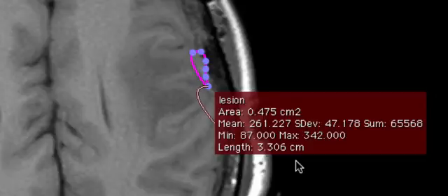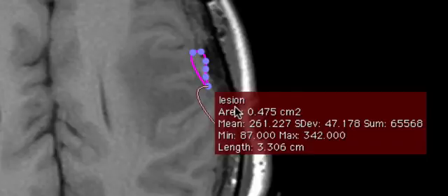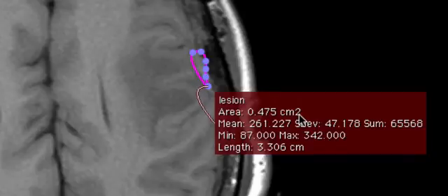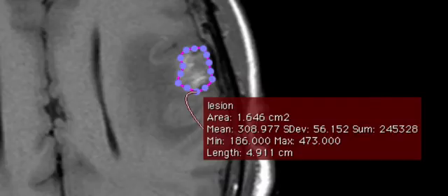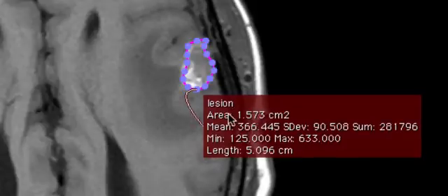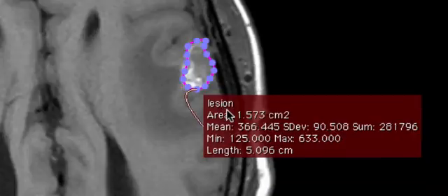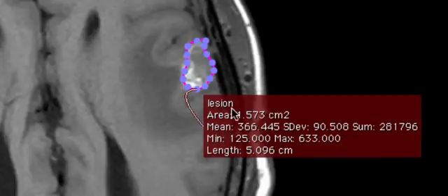Now you will notice that all the ROIs have been labelled as lesion. It also gives you the area of each slice of the ROI. Just go up and down. Once again you see the same title or same name.